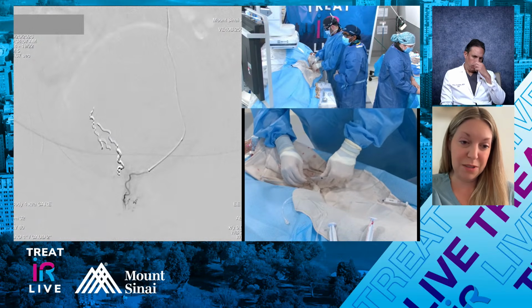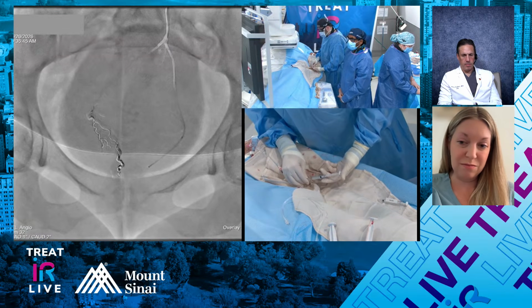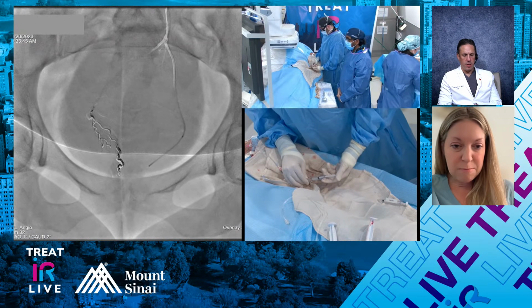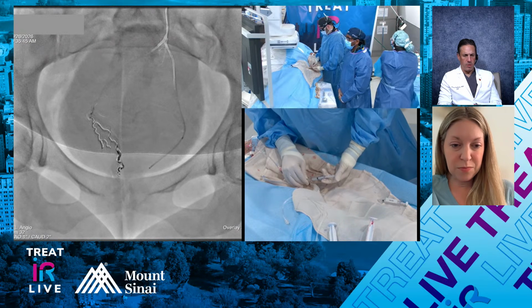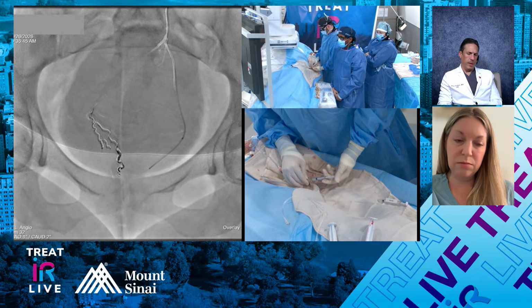What do you typically do? I start with point three. Obviously, it's dependent on how the vessel looks, but usually I start with point three or so because these are so tiny. Jesse, you're using 500s, or I missed what you said before. I'm doing 5 to 7. Okay, got it.